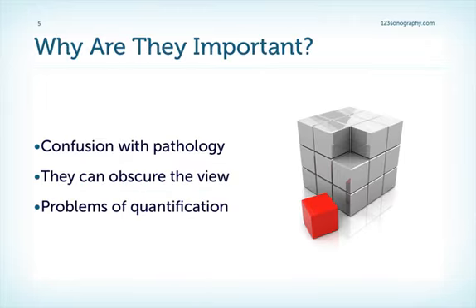Why is it important to know about artifacts? Well, because we can confuse them with pathologies, they can obscure the view to structures you'd like to see, and because quantification can sometimes be a problem.